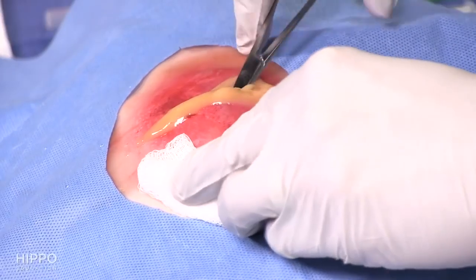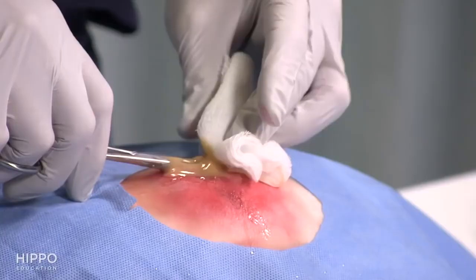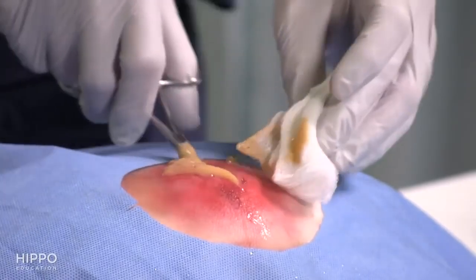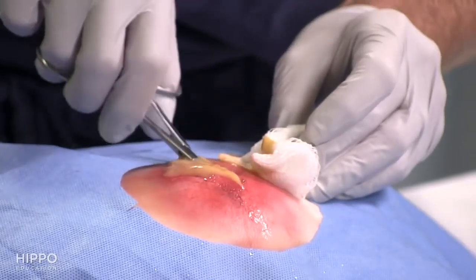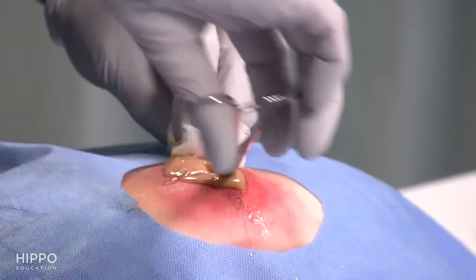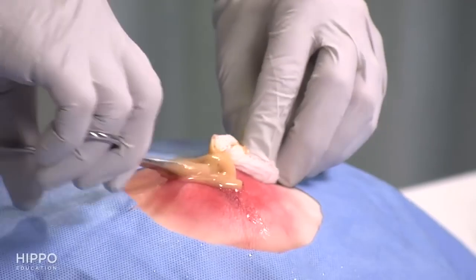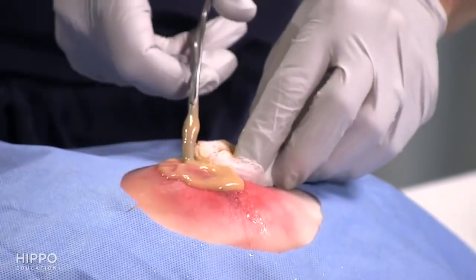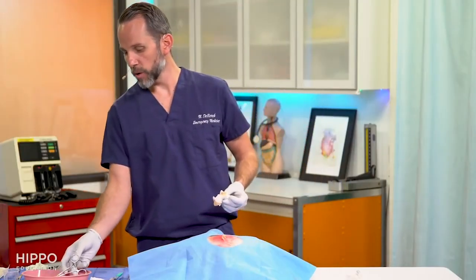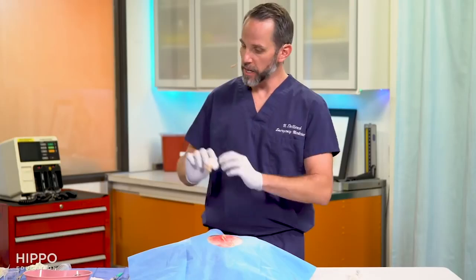If needed, you can reintroduce lidocaine into the abscess after opening it, but move cautiously and gently because it's pretty painful. Use the 4x4s to clean up the pus so it's not running everywhere — these can be messy and can pop out and spray at you, which is another reason eye protection is important. I like to keep a designated area for dirty tools and used 4x4s so everything stays contained.